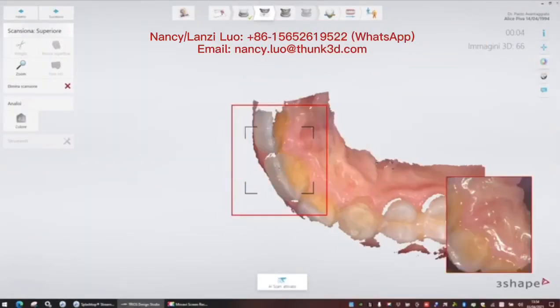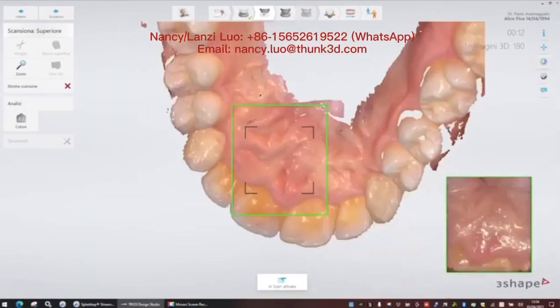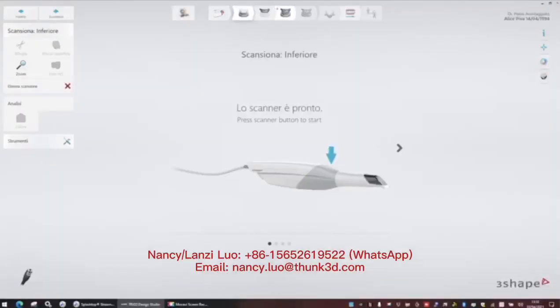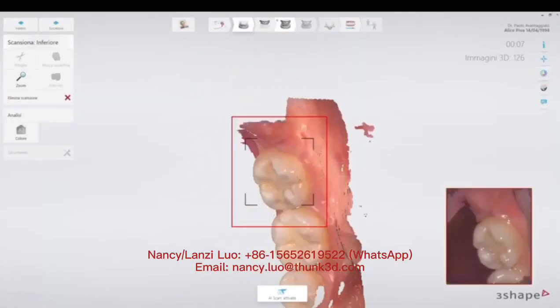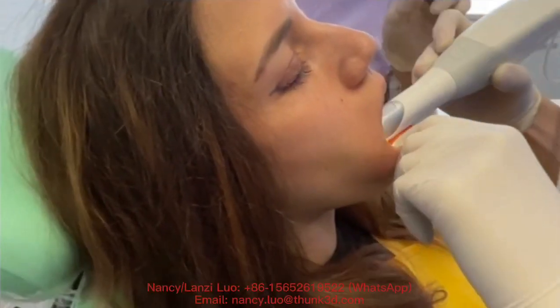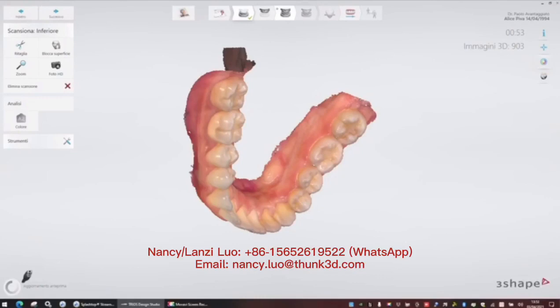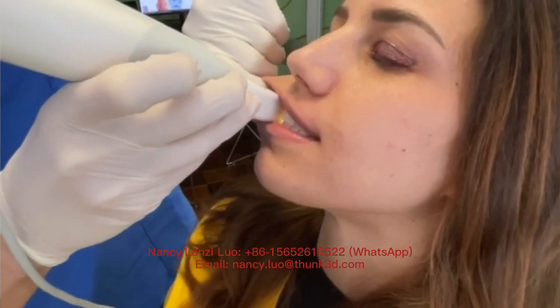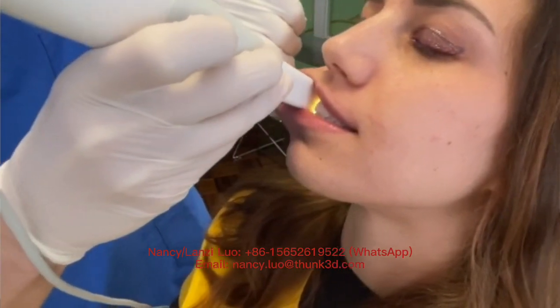We can start with our intraoral scanner, taking the digital impression starting with the lower jaw, then with the upper jaw scan, and then with our bite scan — this is very important. We can start with one side and then the other side, and we need to check that the bite is taken properly.